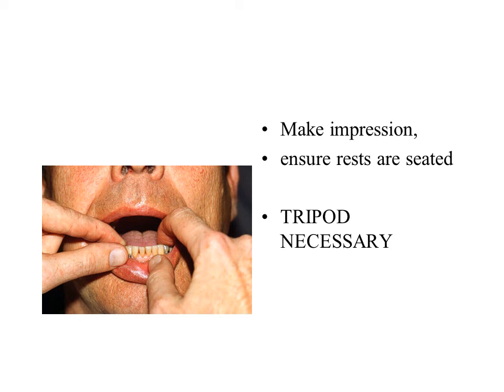Remove all excess impression material. Remember, wherever there is impression material, there will be acrylic when it is processed. Remove all impression material from underneath rests and around clasps and proximal plates. Impression material should remain only on the proposed base area. Replace the impression in the mouth. Ensure that the partial no longer rocks.